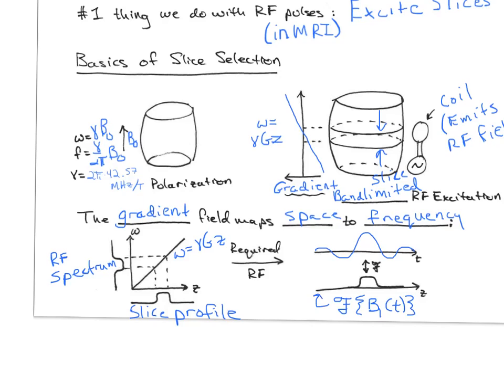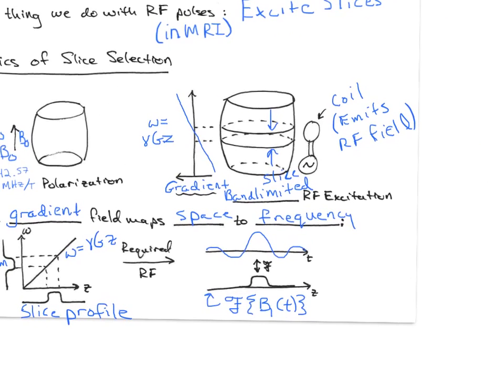It's ideally a perfect rect function. And I should say that this Fourier transform relationship is the most accurate at low tip angles.